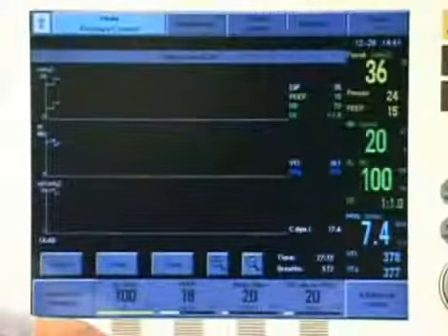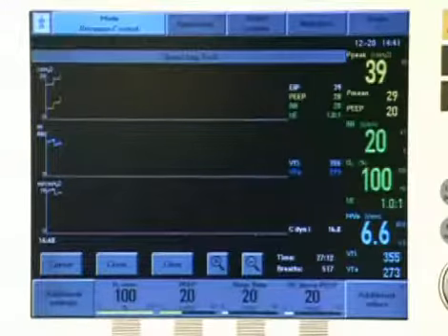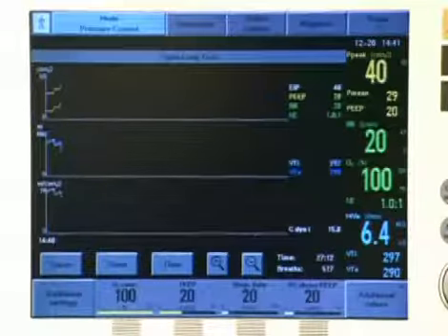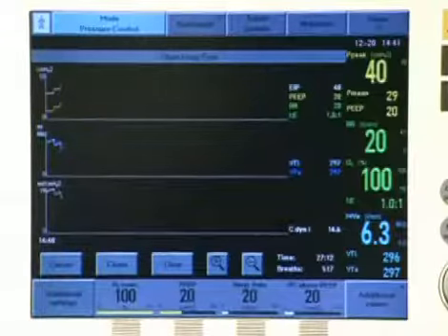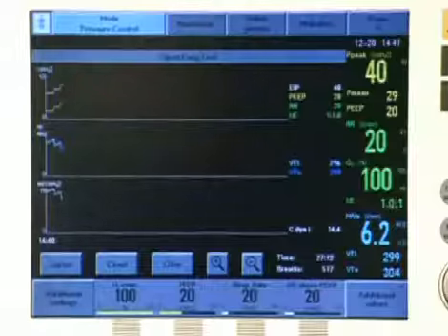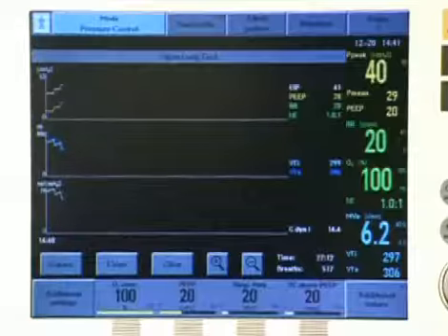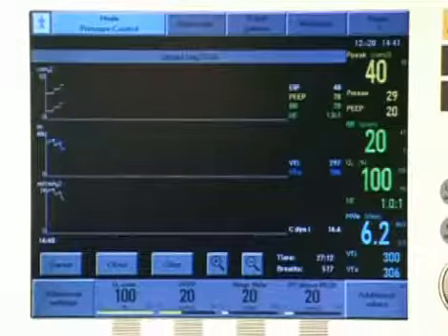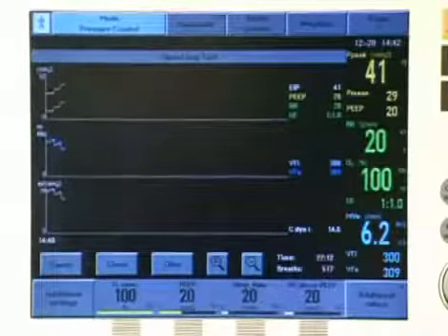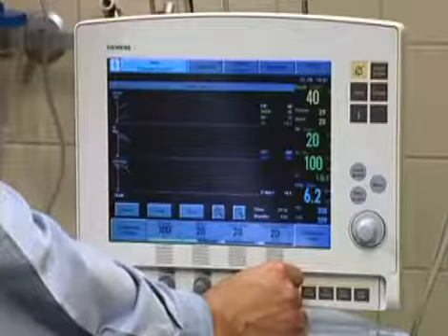In a stable condition, plateau pressure is first stepwise increased to a level of 40 centimeters of water as a consequence of the increase of PEEP to 20 centimeters of water. The PEEP level of 20 centimeters of water will be maintained during the recruitment maneuver to assure the stability of the recruited alveoli in this ARDS lung. After assessing the hemodynamic response and confirming the tolerance to the increase in pressure, we proceed to recruit the lung.